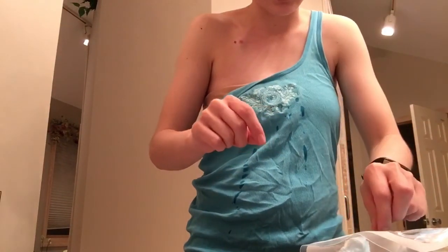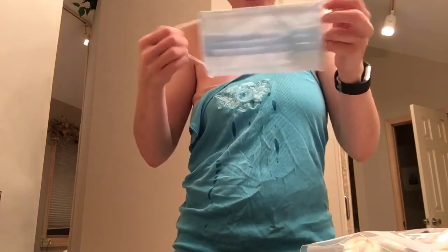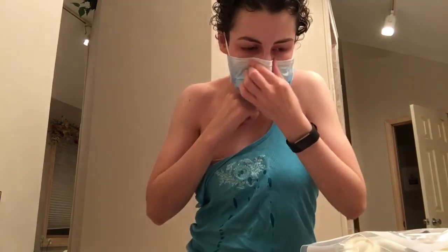And I put all my garbage right in the sink. The first thing I do is very carefully take out, I don't use this tape, I'm allergic to it. Put on my mask. The more white side goes on top. Whoops. This isn't sterile yet, so this is okay. That's why my hands don't have gloves.